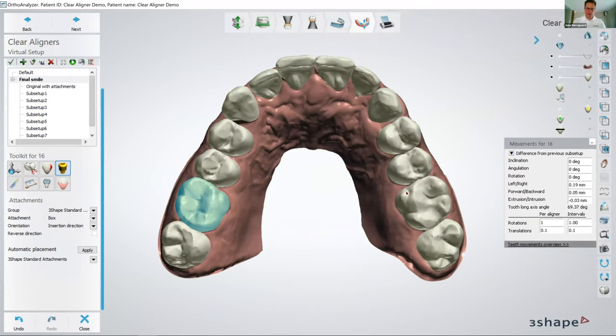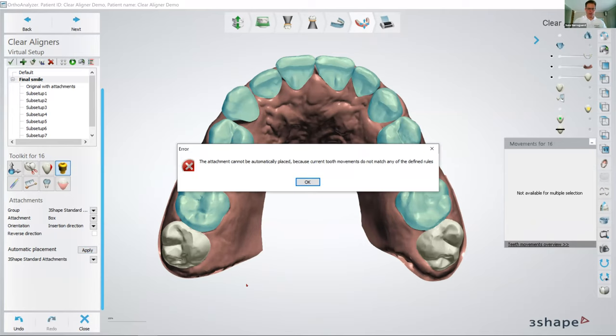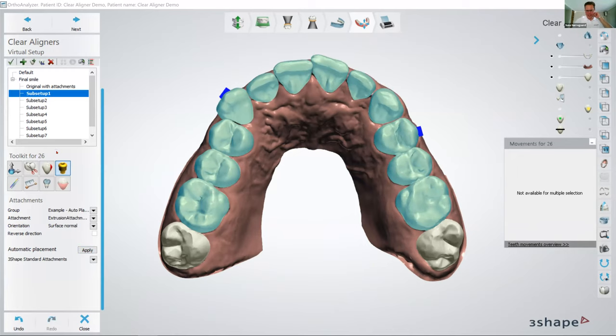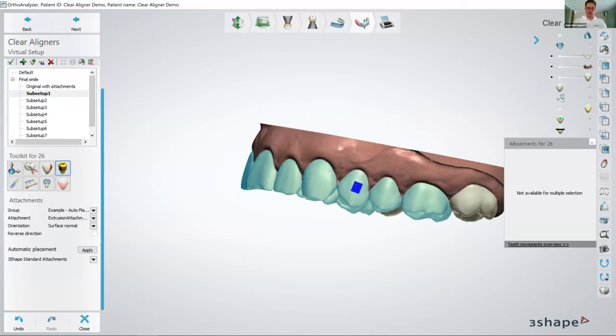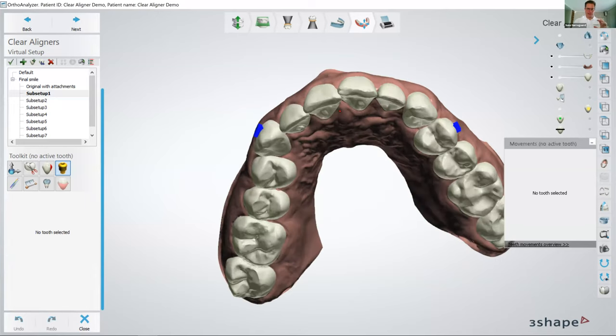Let me just get my mouse straight. So if I select the teeth here and I go for the automatic placement, then the software will look for movements. There's no movement in the final smile, of course, but there might be some movements in the beginning. So let me just go to the first aligner and then let the software do the analysis for this. The software will look at the teeth movement conditions. And if there's a movement that requires an attachment, meaning that the rules that you set up in the control panel are exceeded, then it'll automatically place an attachment on that tooth. So these two teeth here have movements that are bigger than what the force of the aligner is actually able to do to facilitate.